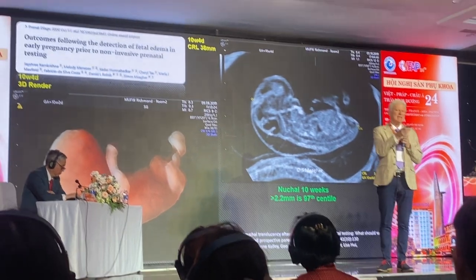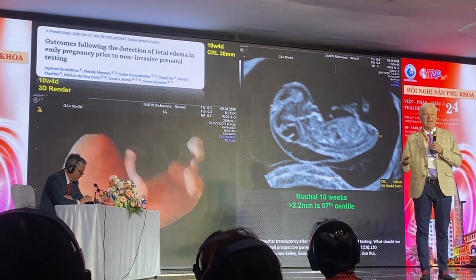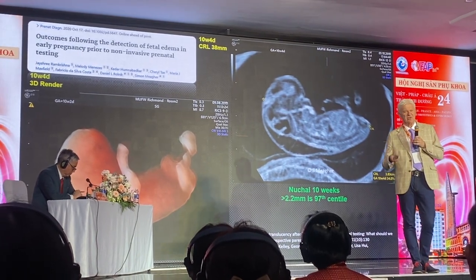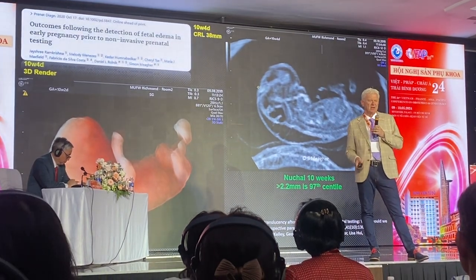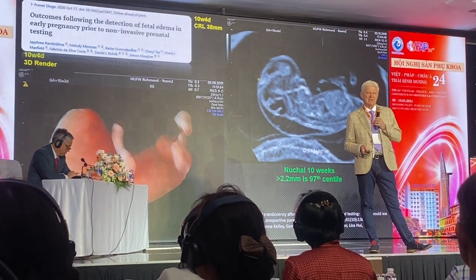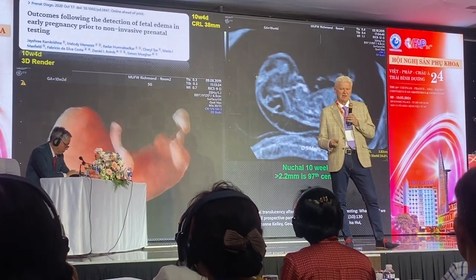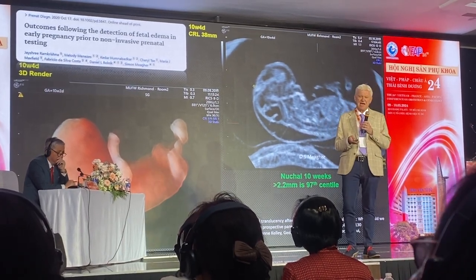You may say, why did Kypros Nicolaides say 11 to 14 weeks? Why did he not say 10 to 14 weeks? If 1% of the population have an increased nuchal translucency and a quarter of these are abnormal, the answer is because back then we were worried about doing early chorion biopsy at 10 weeks and limb defects. And the second reason is 10 weeks is a very hard time to do a transabdominal scan. For these scans at 10 weeks before drawing blood for cell-free DNA, they routinely have a vaginal scan.